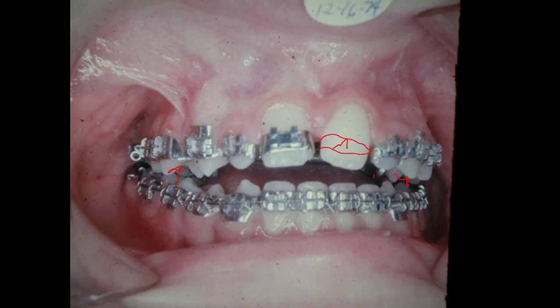This band came off of the tooth, and I took that picture before we reattached the band on what looks like the left central right there. And this is 12 of 74.